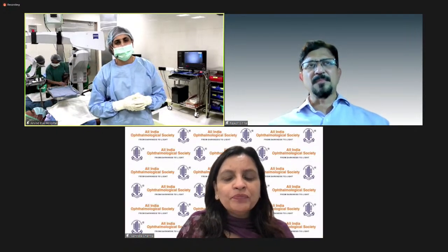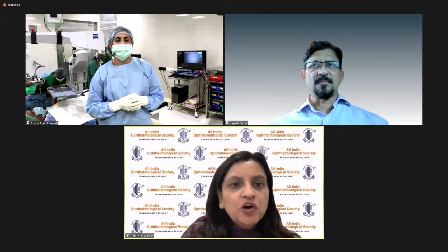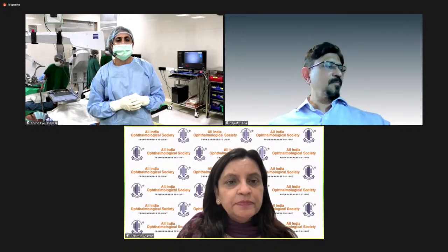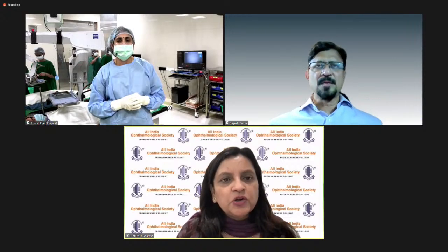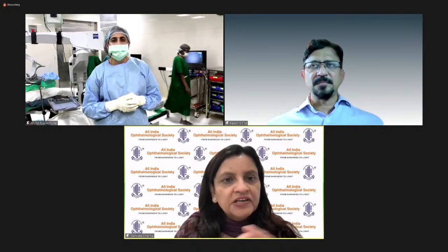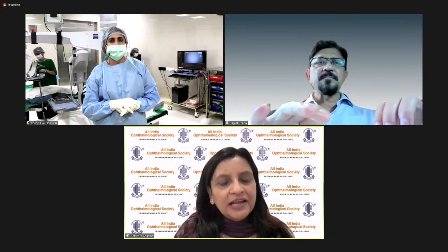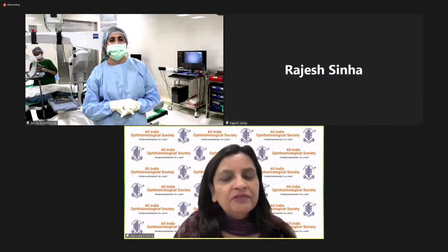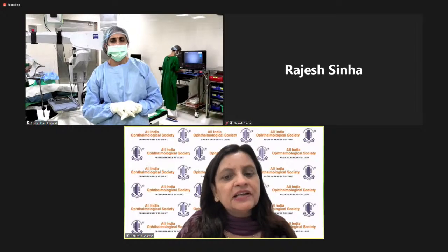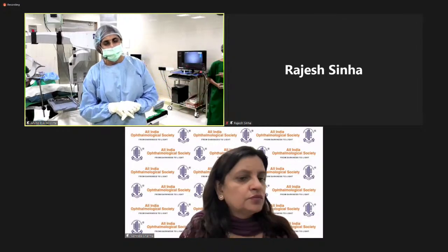We've done a study where we compared toric IOL implantation with Varion and Aura. Almost 90% of the times they agree with each other, but 10% of the times there is a difference, because sometimes you don't get the no rotation required, NRR, on Aura. So invariably, if you go by Varion, you're always hitting the target. Yes. In spite of it, the IOL may still rotate post-op.